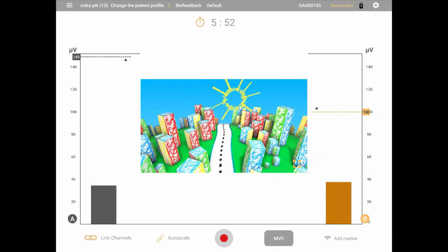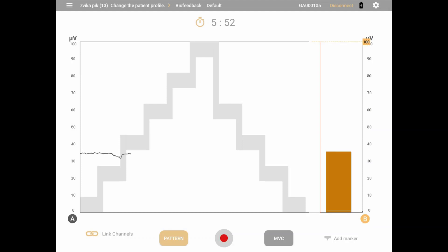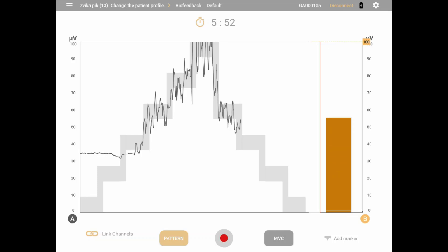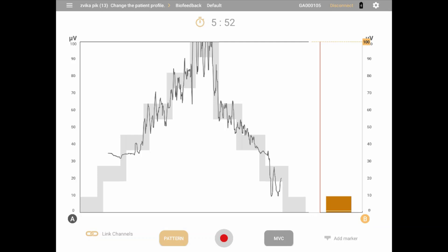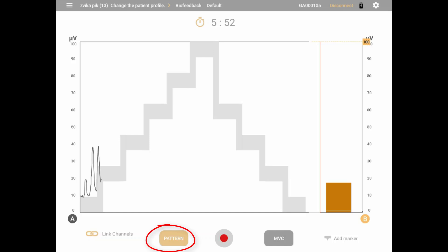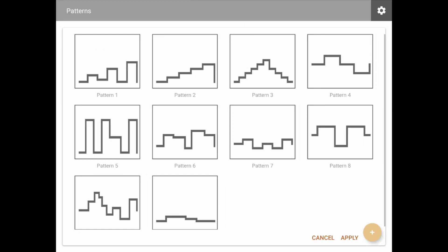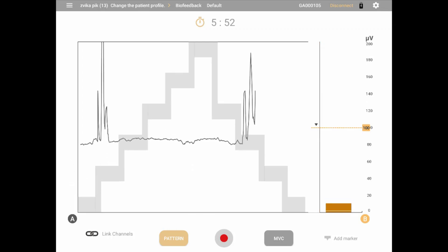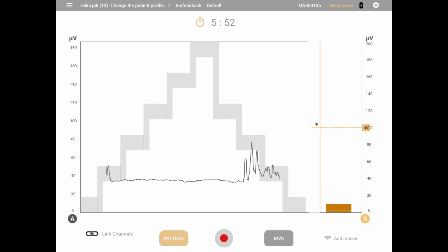The last type is pattern view — a specific type of session in which the patient does not have a threshold goal and is instead instructed to keep the signal within the pattern line. Channel A is the active channel; channel B, if connected, is displayed as a bar graph on the right and acts as a control signal along with its separate threshold. To select a different pattern, click the pattern button on the bottom of the screen. Zooming in and out on channel A will change the signal scale but not the pattern as it appears on the screen, allowing the user to adjust the difficulty level of the task.